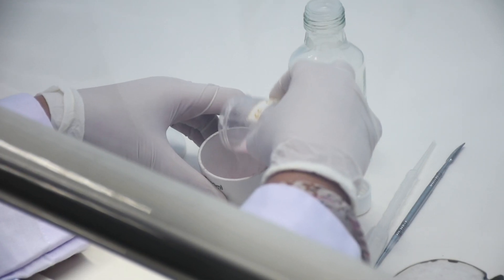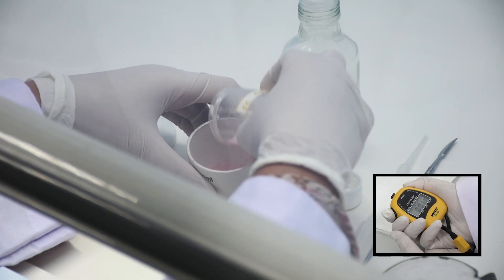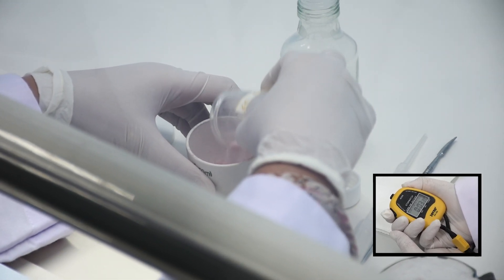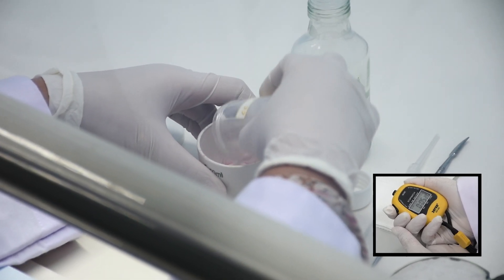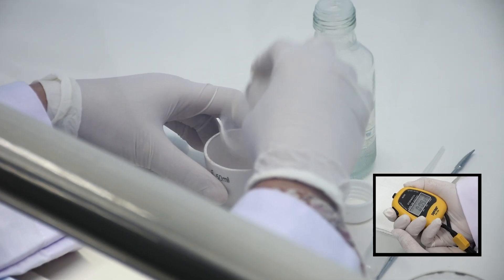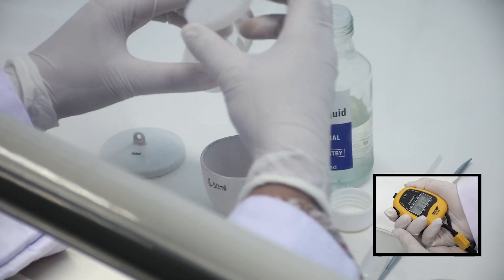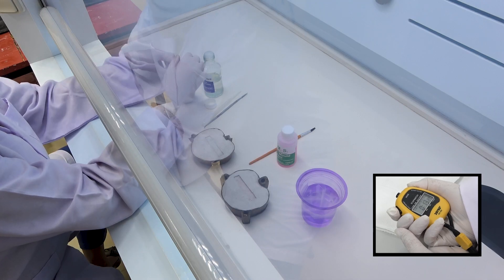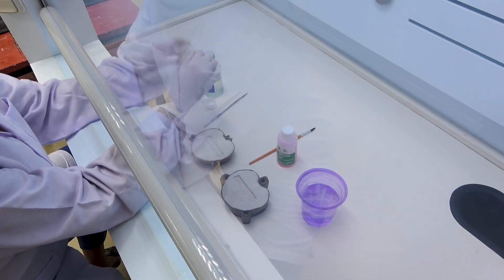Add 5 grams of polymer powder gradually into the dappen dish until all polymer is wetted by the monomer. Start the stopwatch when powder begins to be added to measure setting time.